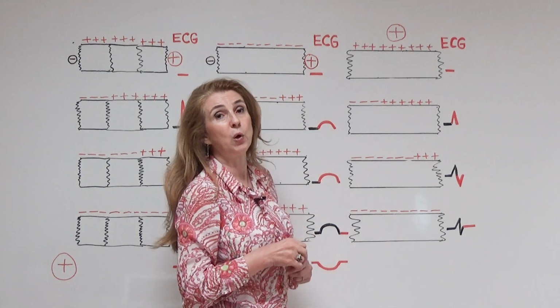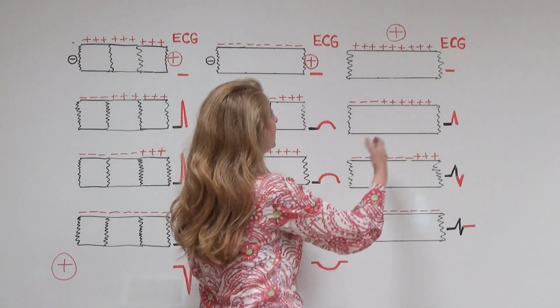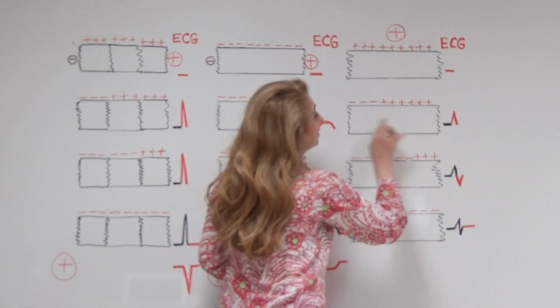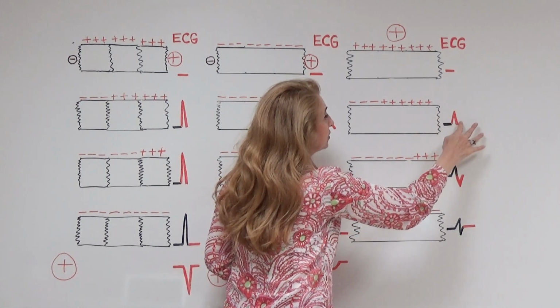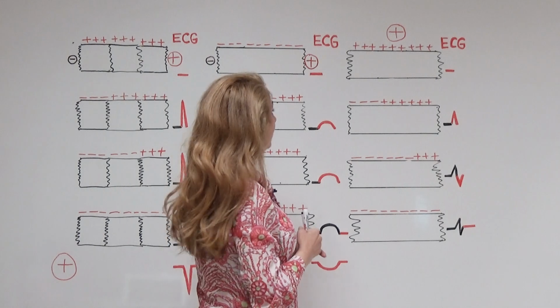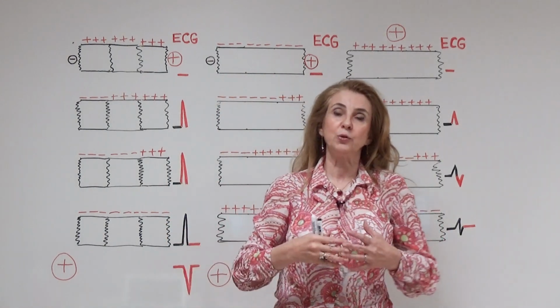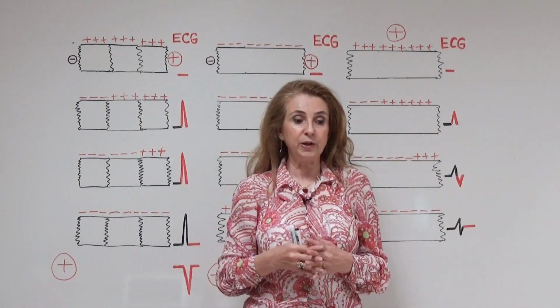Electrocardiography will again draw an isoelectric line. How can we express this in other words? We see here that first the polarization is approaching our positive electrode, and then it is moving away from our positive electrode. So I tried to make an introduction to how the waves are formed in electrocardiography in this video.